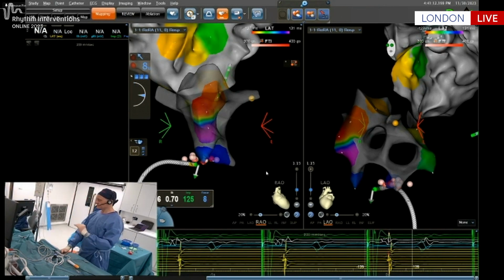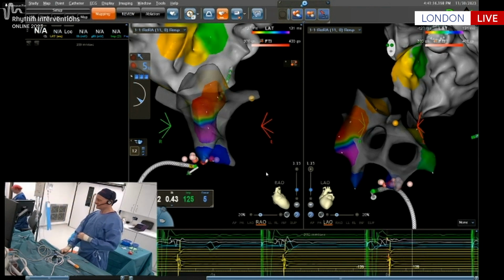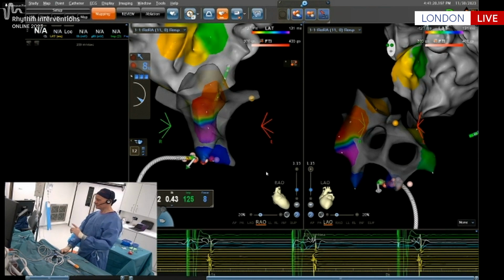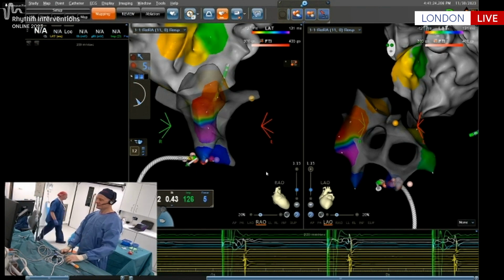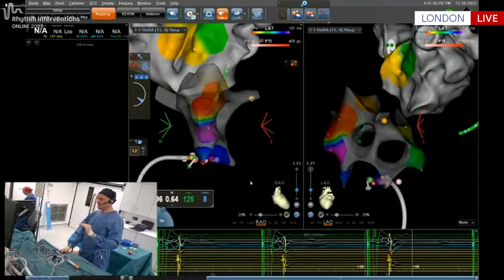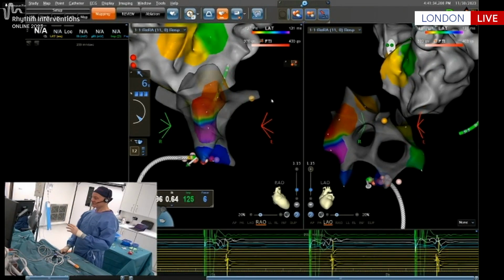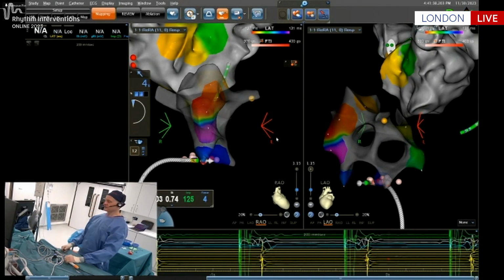As the ventilation moves the catheter back and forward, you can see the proximal signal get very late and then very early, and the distal catheter electrode swap positions with it. And if we look at the force sensing on the Carto, you can see that as they breathe in and out, there's a sort of ridge, and as they breathe out, the force goes, and so we're not able to get the tip in contact with that.